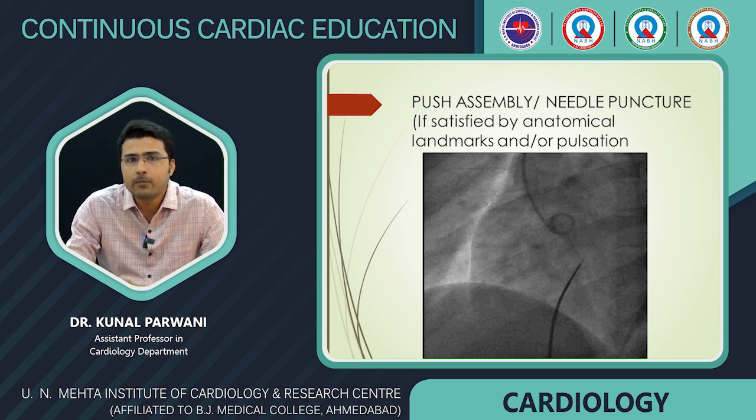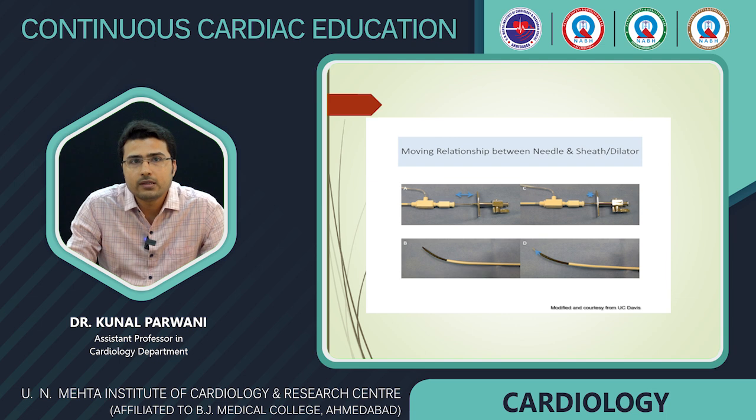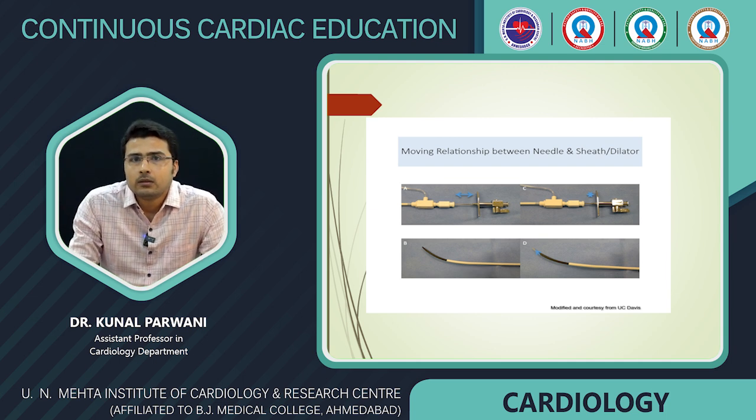The puncture is an abrupt jerking of the needle forward inside the Mullins. The sheath is maintained in the direction of the needle using the right hand and holding and fixing the sheath with the left hand. This should be observed in the fluoroscopy. As you can see in this, the Brockenbrough needle is advanced over the Mullins sheath, and there will be a jerking motion, and that will indicate a puncture. It is more like a feeling of a giveaway. This should be done under the fluoroscopic guidance.